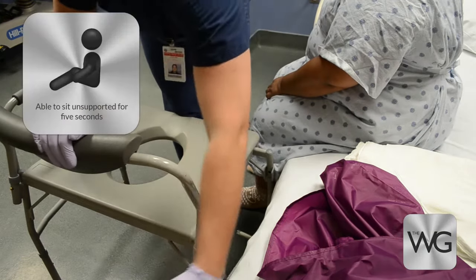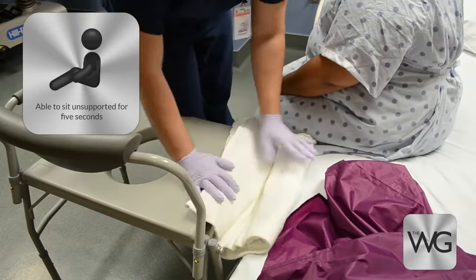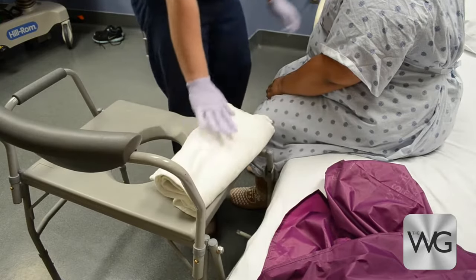First, place the bedside commode near the foot of the bed, remove the side rail, and ensure the commode is slightly lower than the bed mattress.